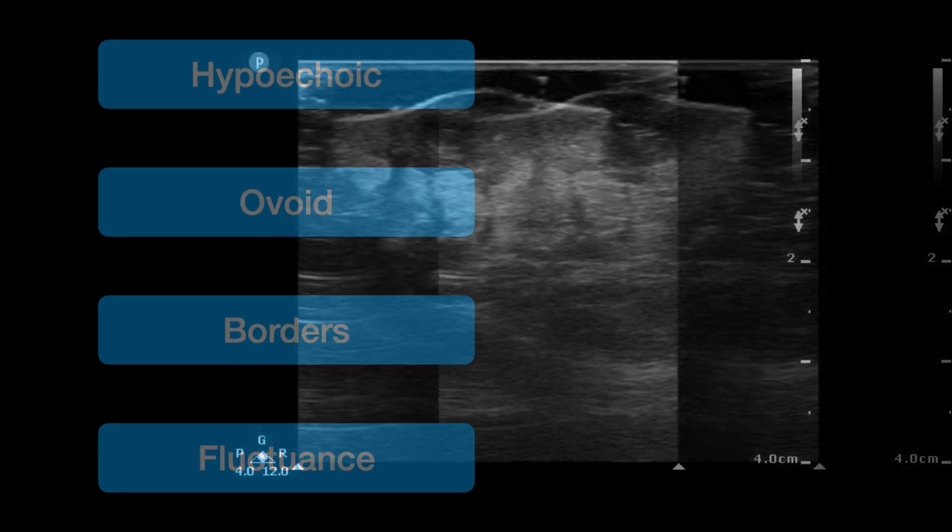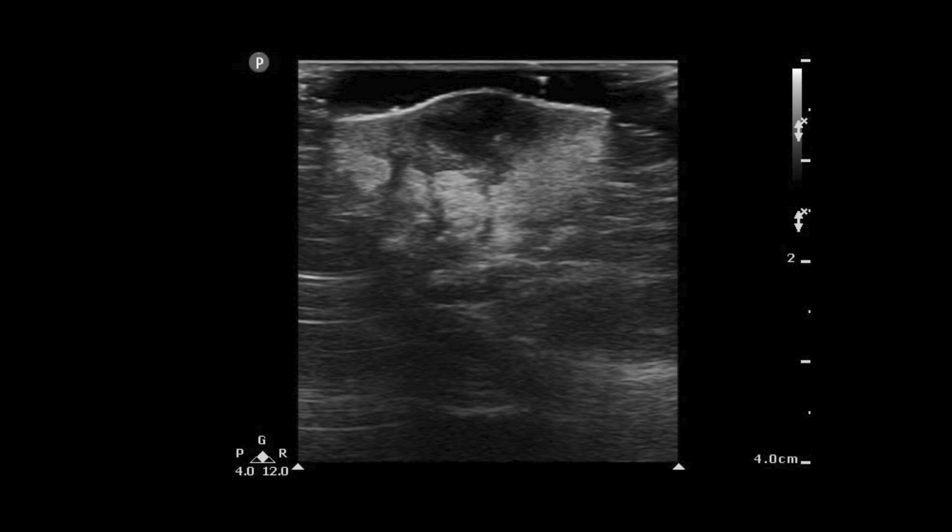So move this over to the middle. Here's our abscess. The red here is that necrotic core. That's liquefied. There's not much we can do about that. That's just a bunch of inflammatory and cellular debris that's left there, just waiting to be released, right? Surrounding that is what they call granulation tissue. I call it that penumbra of inflamed tissue that's probably approaching becoming liquefied, right? That phlegmonous change surrounding that abscess.